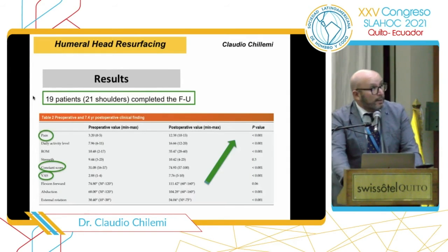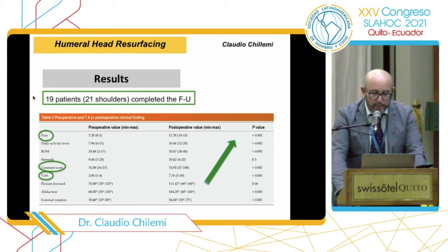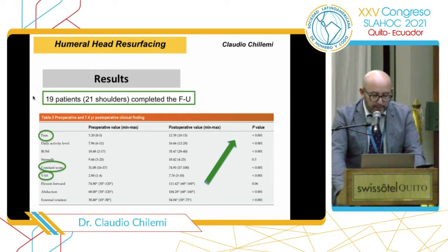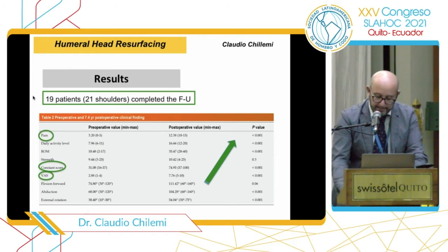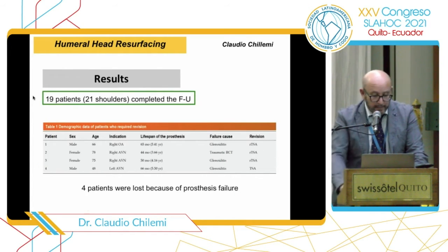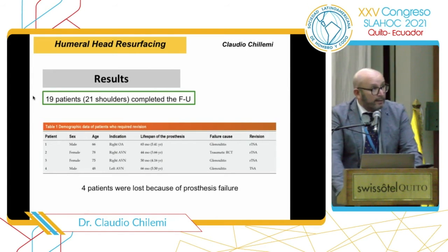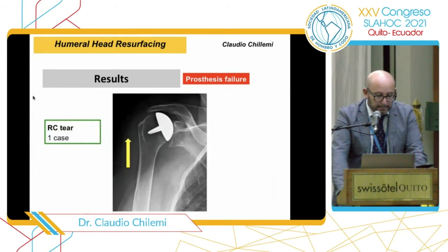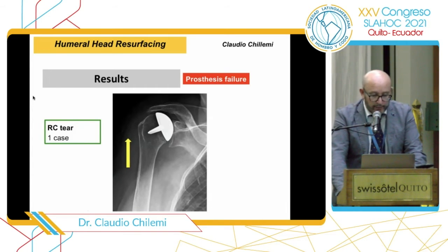So about the results, we refer to 19 patients with 21 shoulders that completed the follow-up. If you have a look, all the results referring to pain, constant score, VAS and active ROM improved over time and remained stable. 4 patients were lost because of prosthesis failure, and as you can see in the table, in 3 cases we had glenoiditis, and in 1 case an old woman fell and had a traumatic rotator cuff tear. In that case we can see the superior migration of the humeral head.